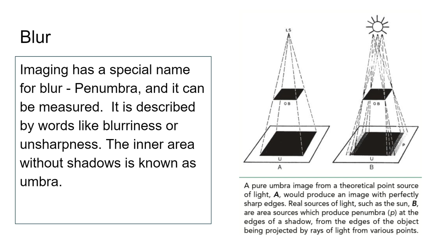If you take a flashlight and put it against the wall, let's see if I can try this here somewhere. Kind of see the blur around the edge. Not as distinct as the middle. That's kind of the penumbra.